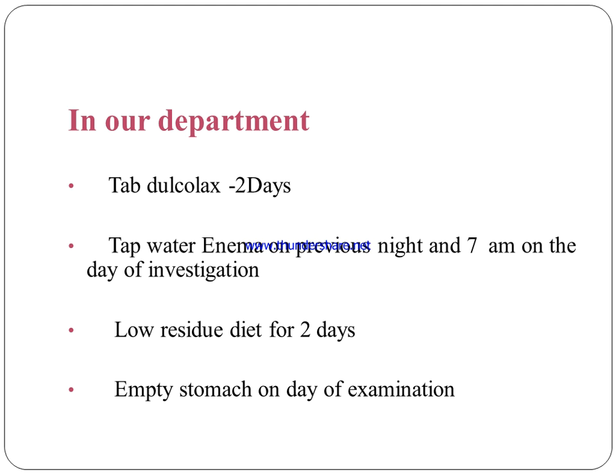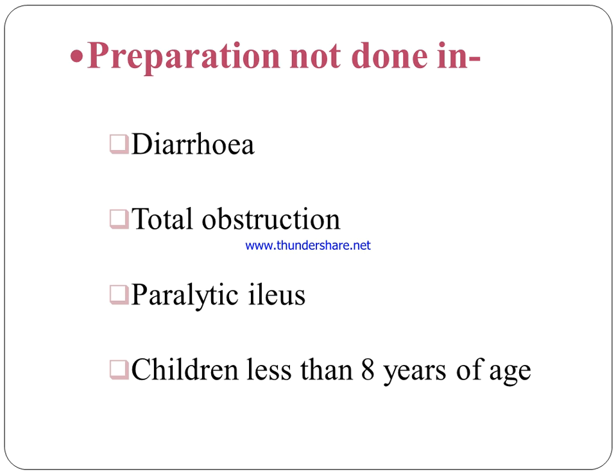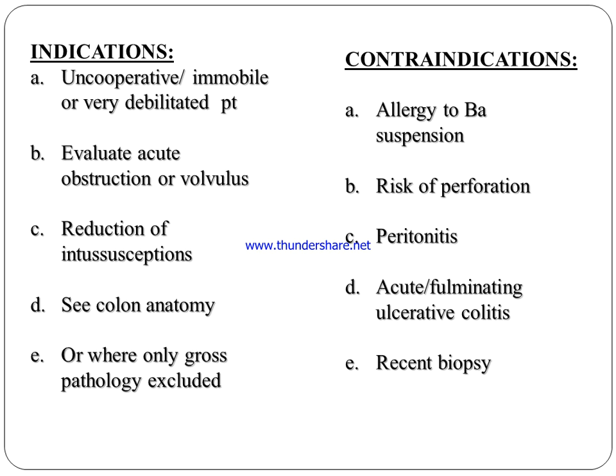In our department, we use a Dulcolax tablet 2 days before, a tap water enema on the previous night, and a tap water enema at 7 a.m. on the day of investigation. A low residue diet 2 days before, the same. Empty stomach on the day of examination. Preparation is not done in diarrhea, total obstruction, paralytic ileus, or children less than 8 years of age.